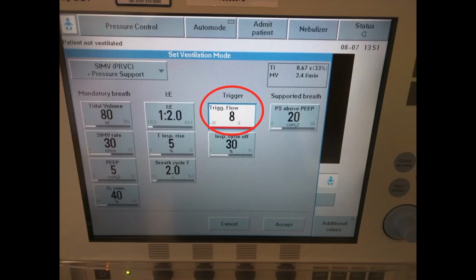I've already mentioned the ventilator by default uses a flow trigger, and it interprets any gas that it sends out that doesn't come back as the patient taking it, and then it will send a breath to the patient. So if there's a leak around your endotracheal tube, that's one reason why gas would go to the patient and not come back. And in this circumstance, you may want to make the trigger slightly lower to try and compensate for that leak.